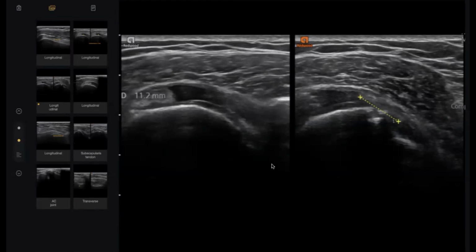Show me where the injury is. I try to move the mouse. This region. Excellent, you are brilliant. Here he measures something, but really this hypoechoic area is the defect or the gap. Very important, my colleague. Leave the mouse. Thank you, doctor.